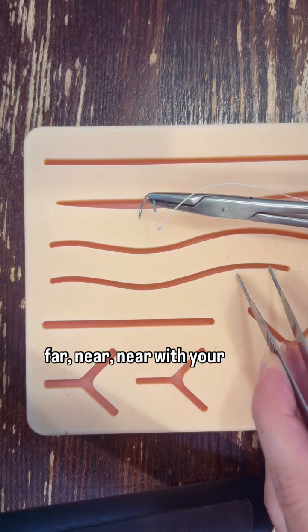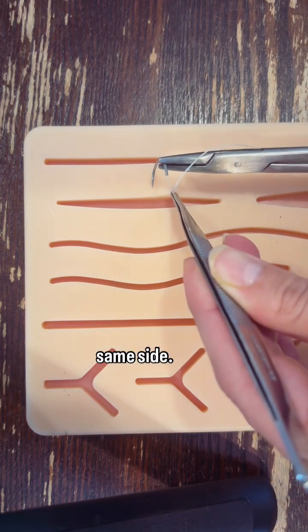You're going to go far far, near near with your suture, and then tie on that same side.